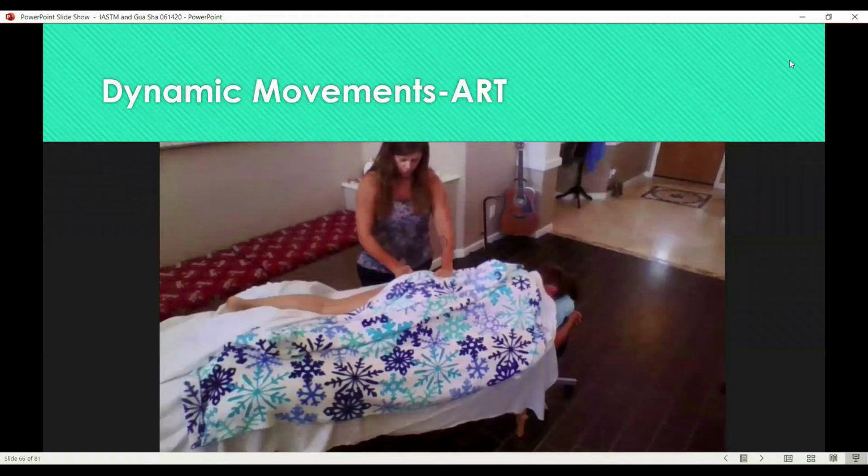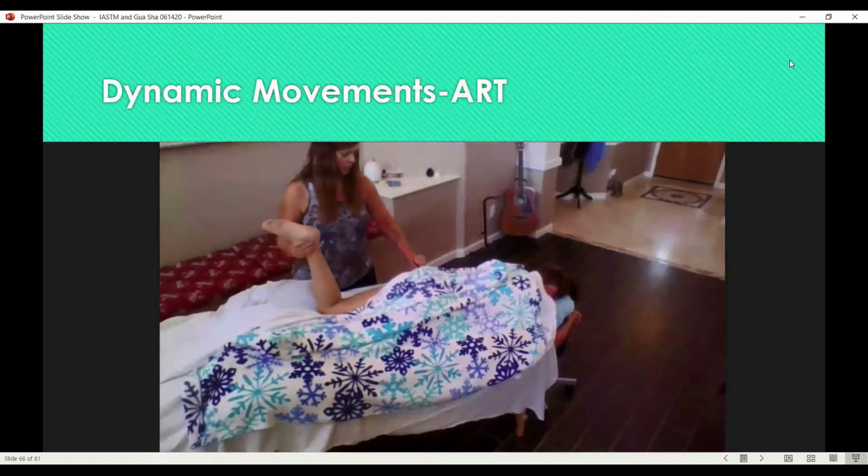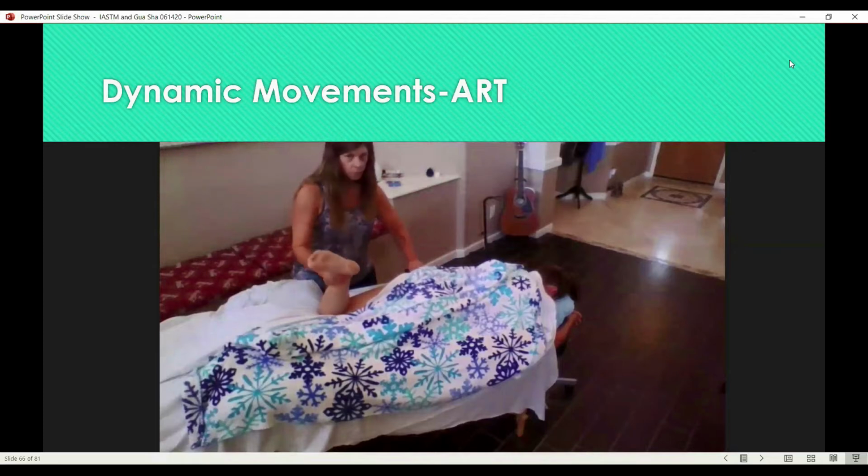Here we can see working across the glutes. First sweeping for adhesions, then maybe I find one and I start doing some brushing. Right, and strumming, and here we're moving the leg in internal and external rotation while I'm working across the fibers.